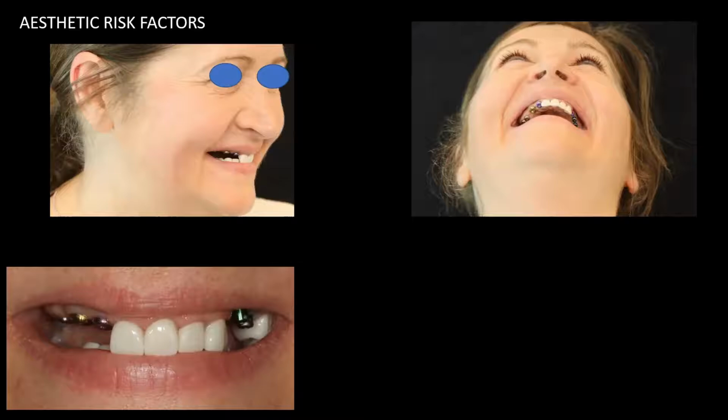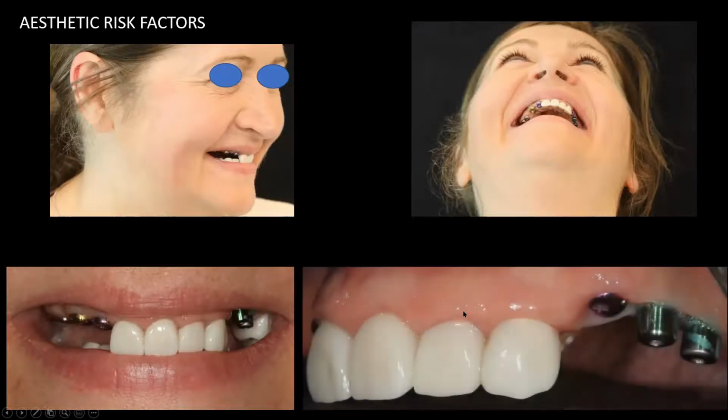This patient is never going to be happy, because there's no way you can create a transition from this area to create a nice smile, or from here. This patient wants to know why this implant is so high up there.